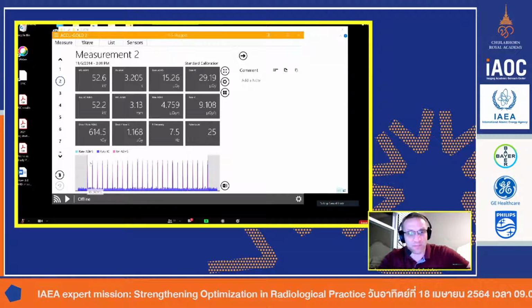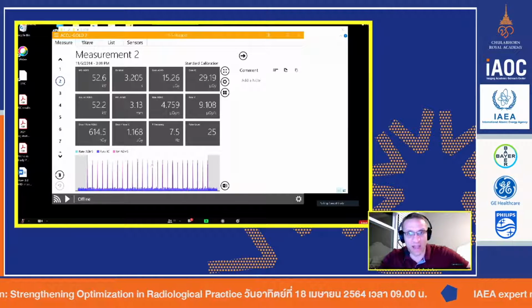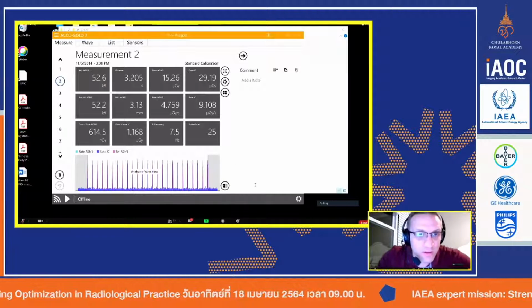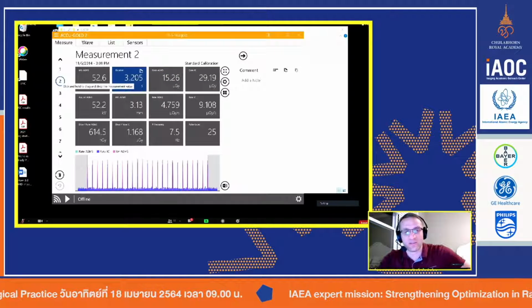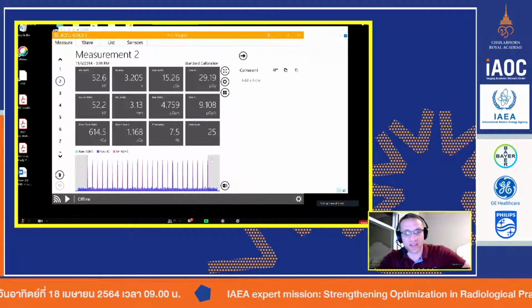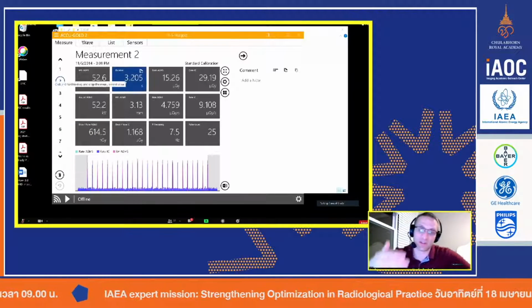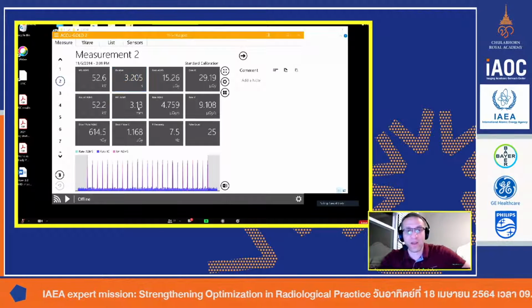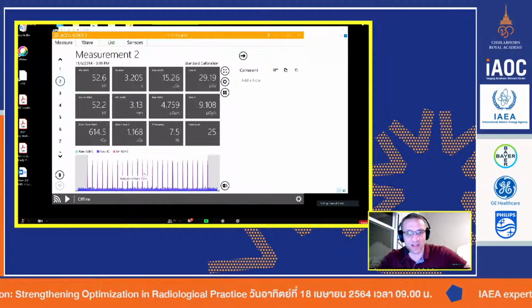And here you can see the pulses. So what I can do is I can count out, I know, let's see here, duration. This was 3.2 seconds. So over these 3.2 seconds, I can count how many pulses I have and obviously divide that by 3.2. That's obviously my pulses per second. Or I can't do that here because my system's not actually hooked on.